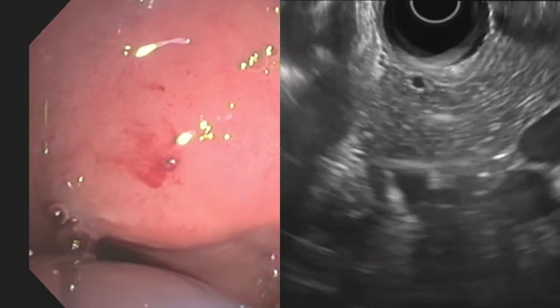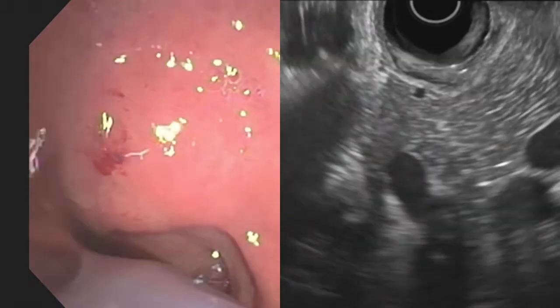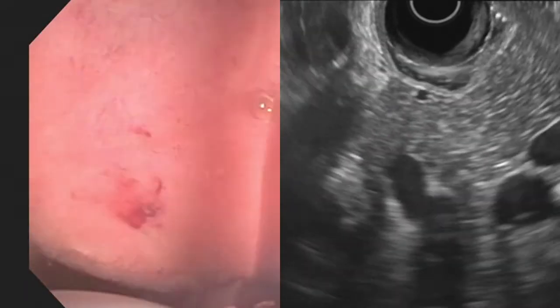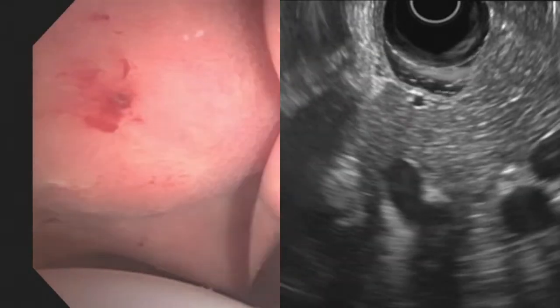Therefore, water was instilled into the duodenal lumen using a syringe in order to obtain better delineation of the layers of the duodenal wall.